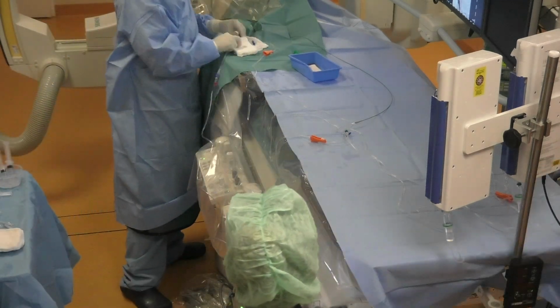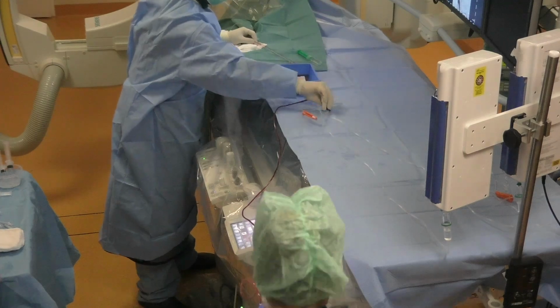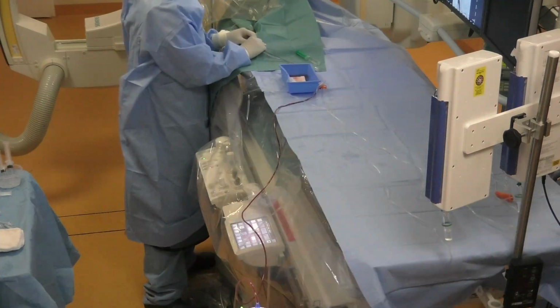We connect the pipe directly to the guide catheter and aspirate, and now we take the Sophia catheter and push it through the guide catheter and start the aspiration through the Sophia catheter. We perform the aspiration thrombectomy step by step, and every time we go a little bit further with the aspiration catheter, but we stay in the vertebral artery. It's very important to aspirate while retracting, not while pushing, to avoid dissections.